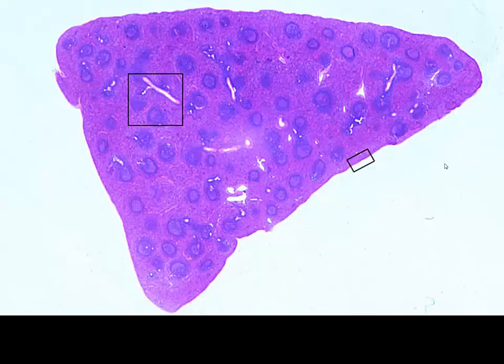All right, shifting gears again, moving into the spleen. And when you see a low mag shot, which looks like the skin of a leopard or a cheetah, your first gut instinct should be, I am looking at the spleen, looking at the darker white matter, white pulp, and looking at the intervening tissue, which is the red pulp.